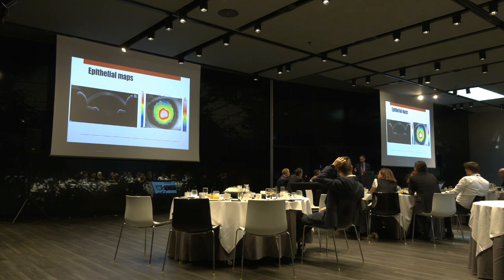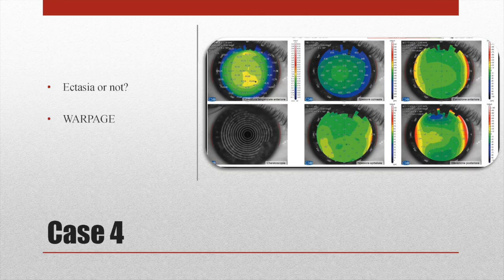Yeah, but it doesn't help you in the diagnosis. In the diagnosis, no, but in the treatment, yes. Yeah, I'm talking about diagnosis. Yeah. So this is case 4.